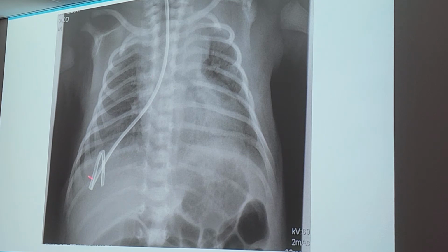So what happened here, do you think? Where is it? Right side. Right lung, correct. So remember last chapter for Mr. Donahue, we said the right bronchus is what? Shorter and wider. So when we aspirate, where does it normally end up? In the right lung. The right lung. Foreign object.